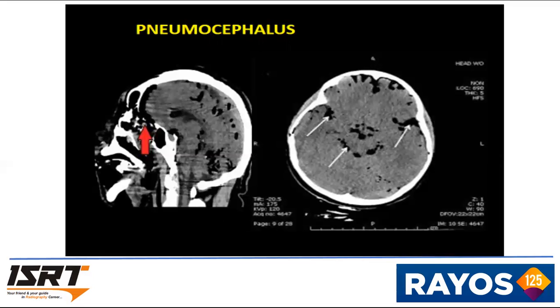Like the calcification, there are some occasions while you are dealing with some traumatic cases or real emergency pathology cases, where you can see some air bubbles in the brain. These are also quite common during severe trauma to the brain. Trauma or underlying pathology, never get upset seeing such matters.